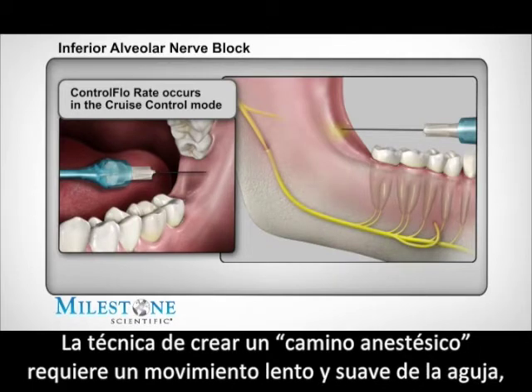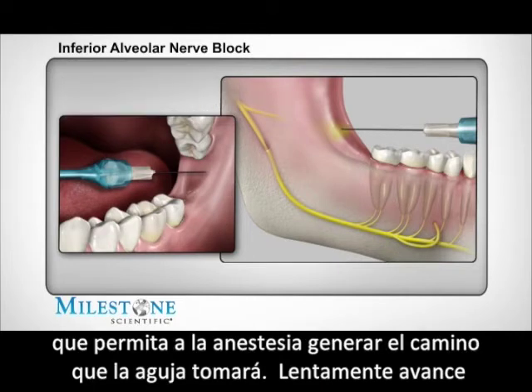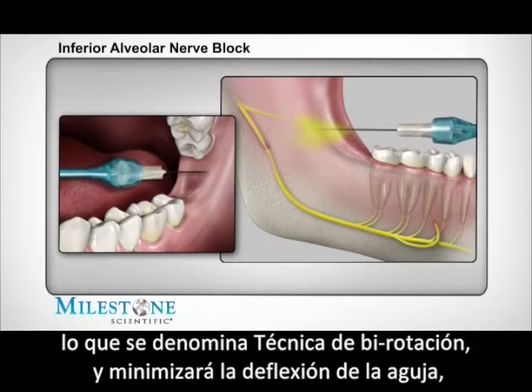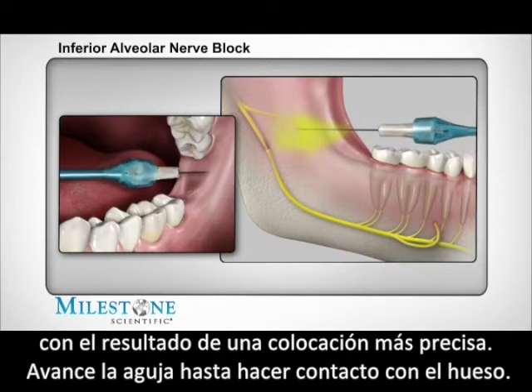The technique of creating an anesthetic pathway requires a very slow and deliberate needle movement, allowing the anesthetic solution to deliberately precede the path that the needle will take. Slowly advance the STA handpiece while simultaneously rotating the handpiece using a back and forth motion. This is called the bi-rotational insertion technique and it will minimize needle deflection, resulting in more accurate placement of the needle tip to the intended target.